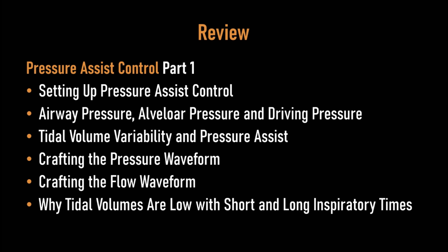We talked about tidal volume variability and pressure assist. And pressure assist is when the patient takes a breath on pressure control, and I described why the tidal volumes are greater than with a controlled breath. I discussed crafting the pressure waveform, crafting the flow waveform, and I explained why tidal volumes are low with very short and very long inspiratory times.